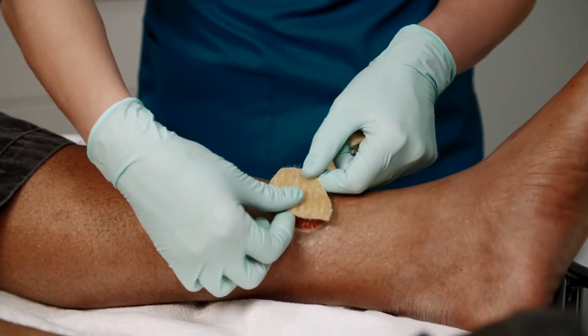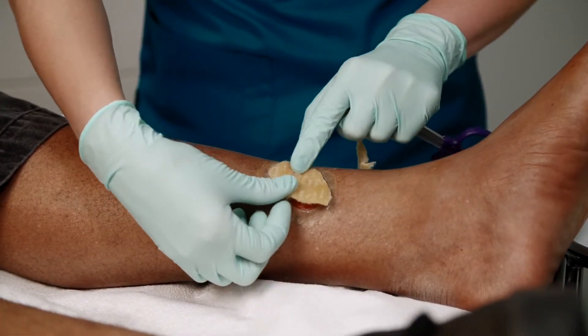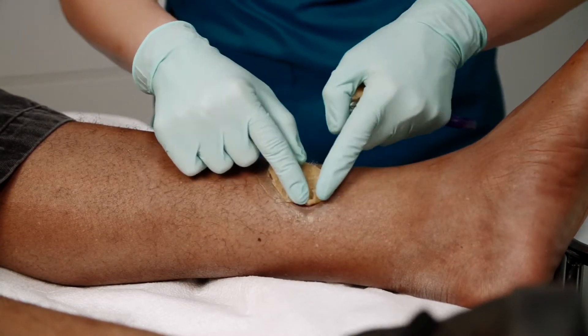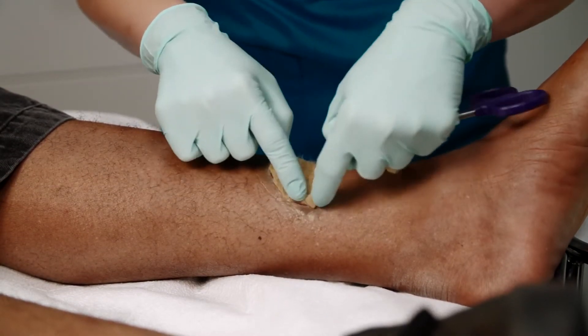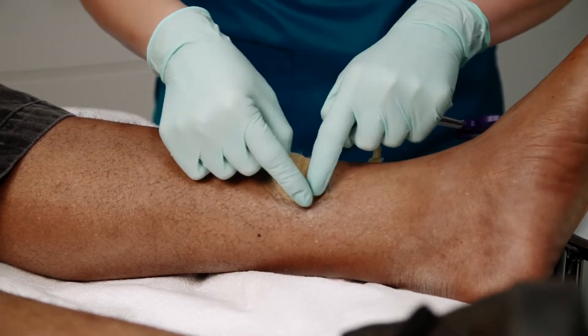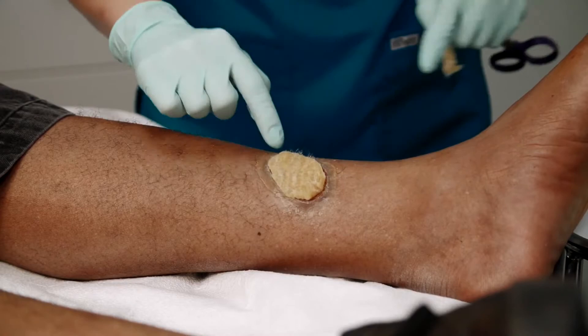Gently place it onto the wound bed. Once applied, because the dressing is pliable, simply roll the edges of the perimeter of the dressing to fit correctly inside the wound edges.